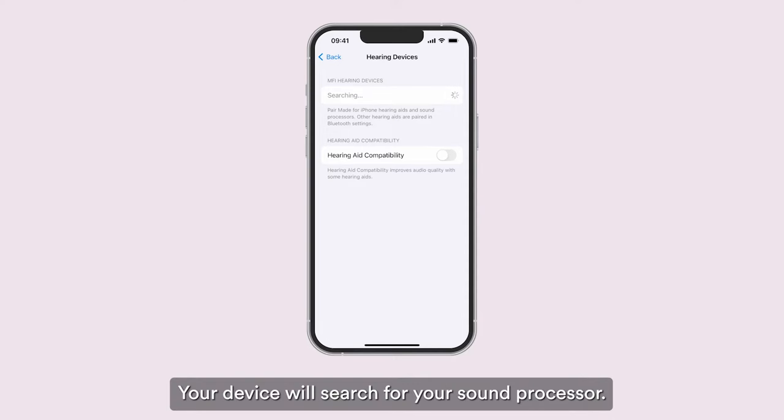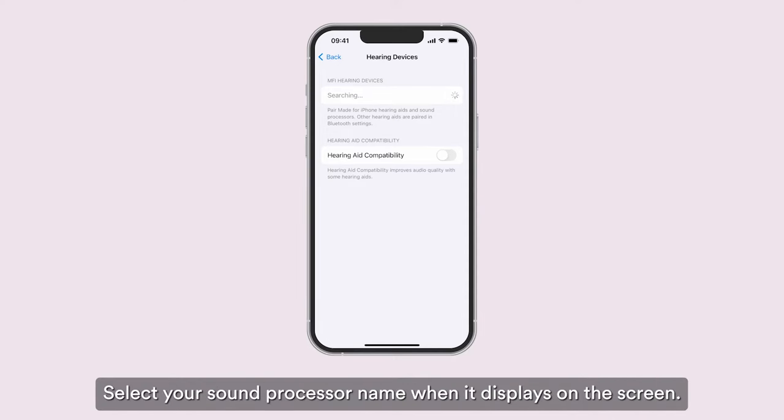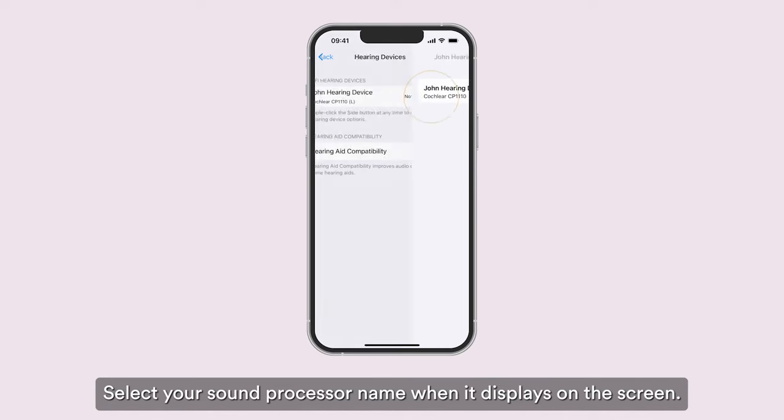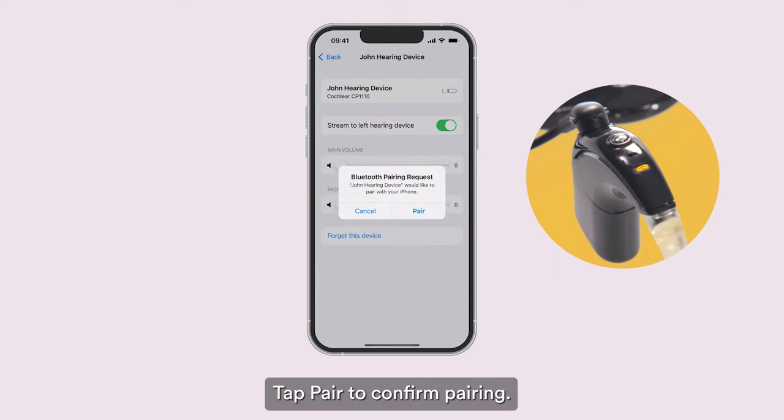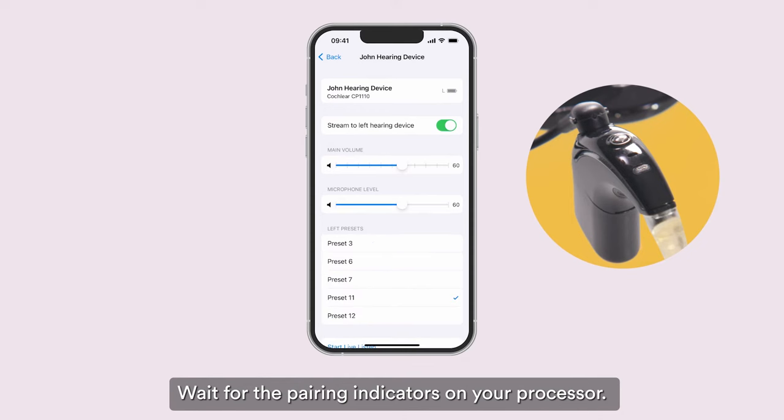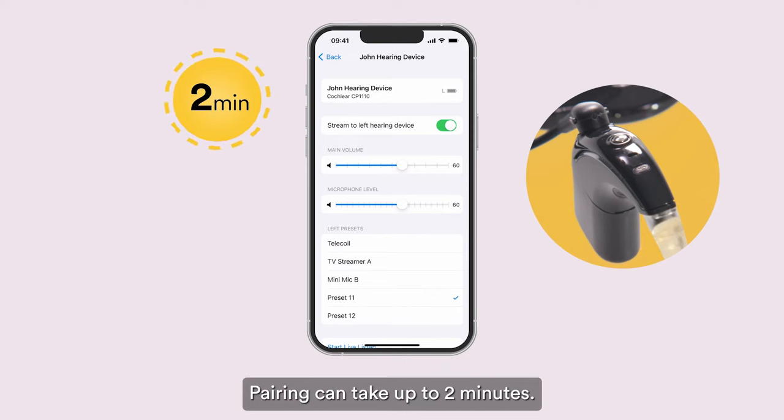Then turn your sound processor on again. Your device will search for your sound processor. Select your sound processor name when it displays on the screen. Tap Pair to confirm pairing. Wait for the pairing indicators on your processor. Pairing can take up to two minutes.